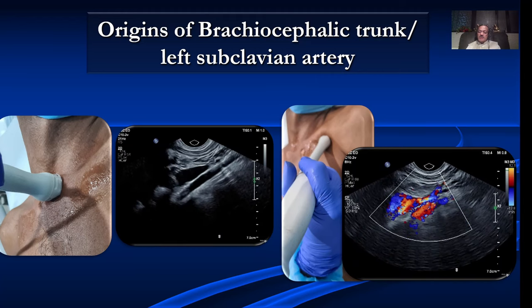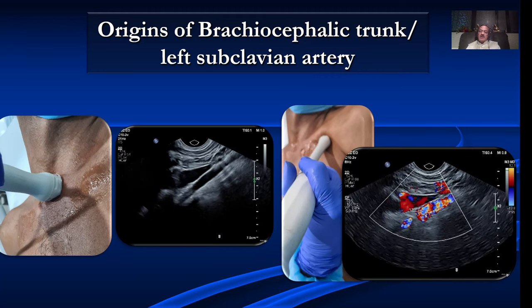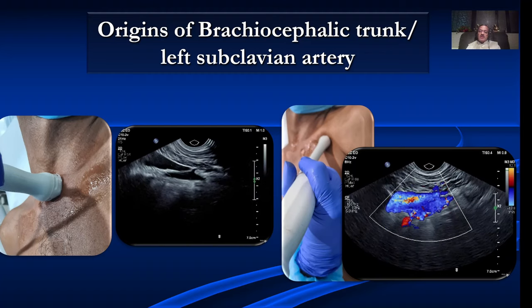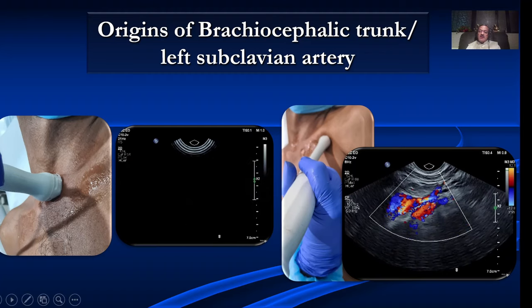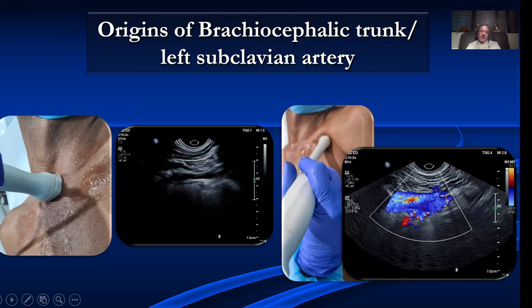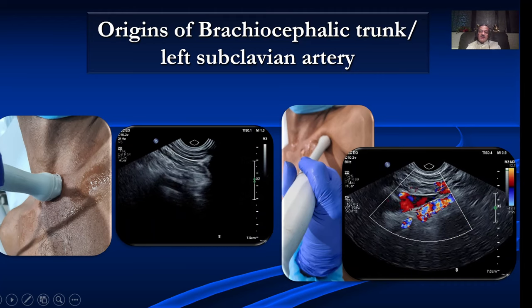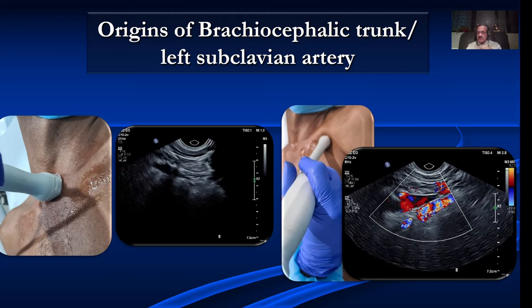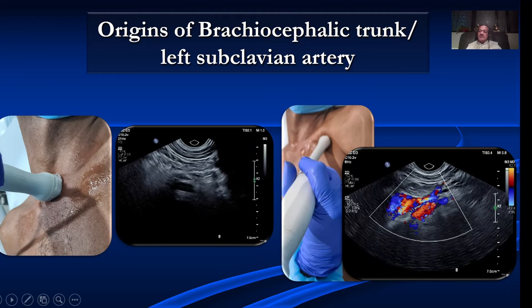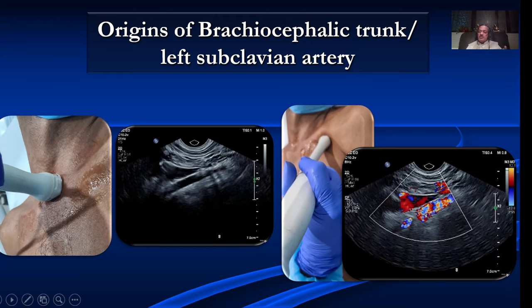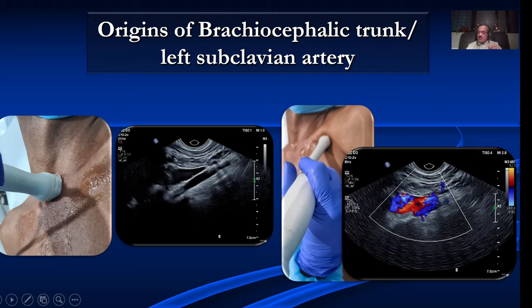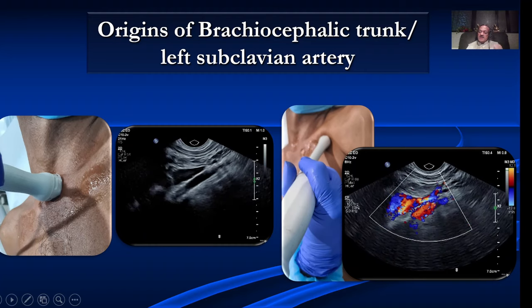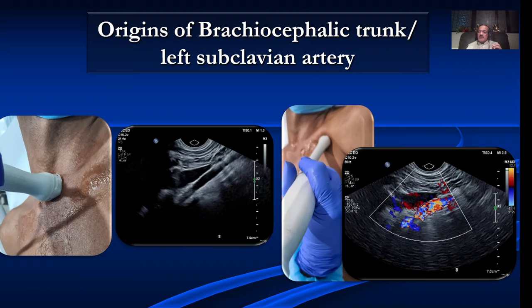One of the most important problems with the subclavian artery is evaluating the origins — the origin of the left subclavian artery and the origin of the brachiocephalic trunk — because they are hidden by bones. We typically use either a cardiac probe with a very small footprint or a transvaginal probe to look at origins. This is important because very often a stenosis is at the origin of the subclavian artery.